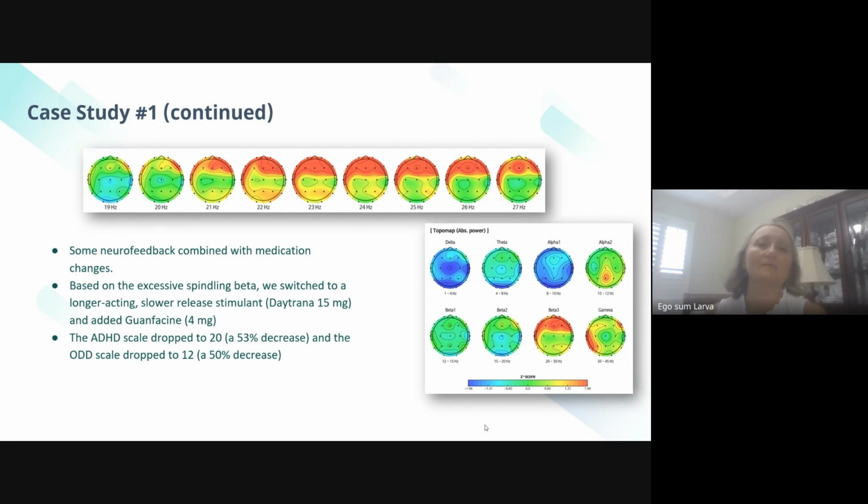A lot of times, I'll send them to Corey, and oftentimes they've tried a bunch of different medicines, so we're often trying to gather as much more information as we can to help guide us with our choices. And so it's really helpful to do a quantitative EEG with Corey, because that helps us to get some more clues about what direction we should go in.